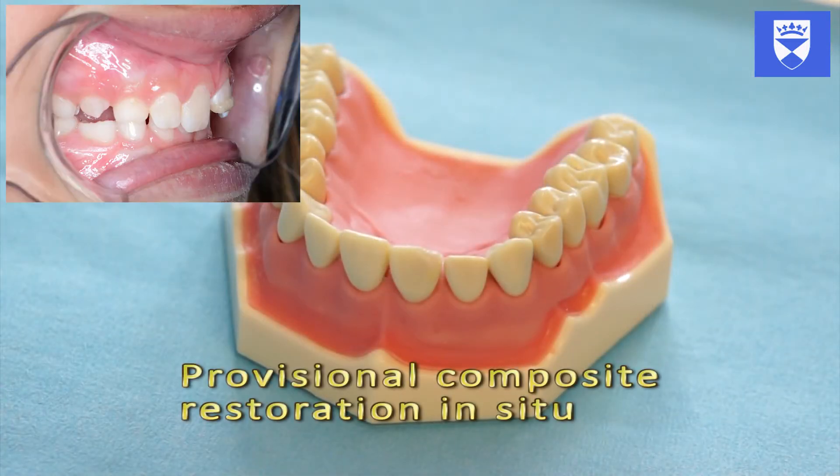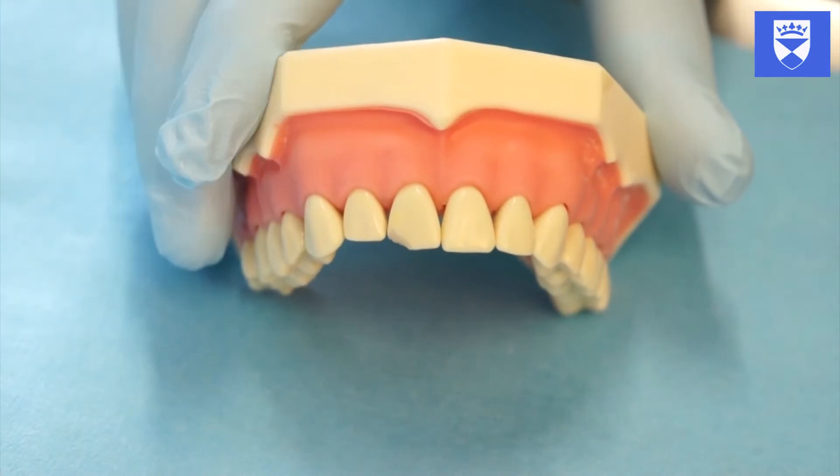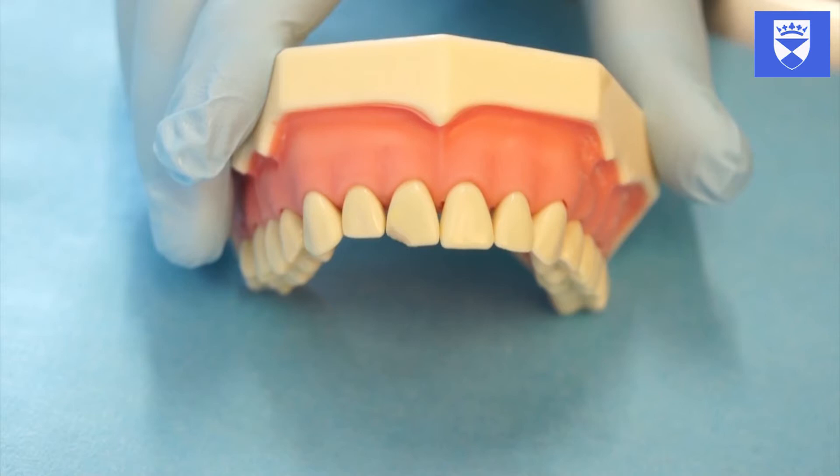In this video we can see that the fracture has been temporized with a composite bandage. Whilst the tooth is still wet with saliva, choose the appropriate shade of composite under natural light and using the appropriate shade guide.